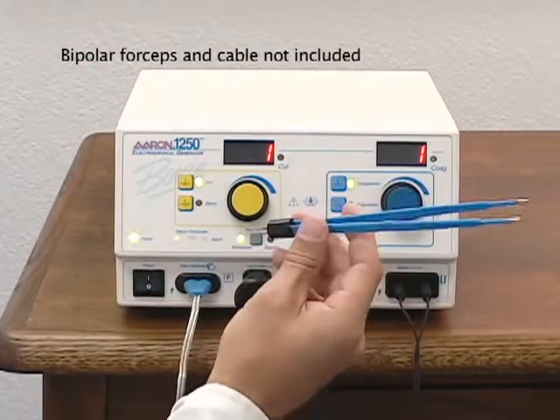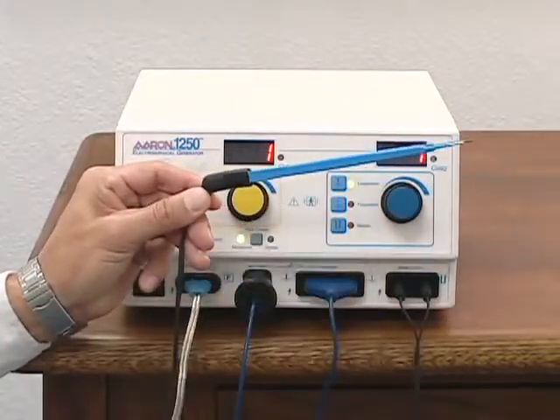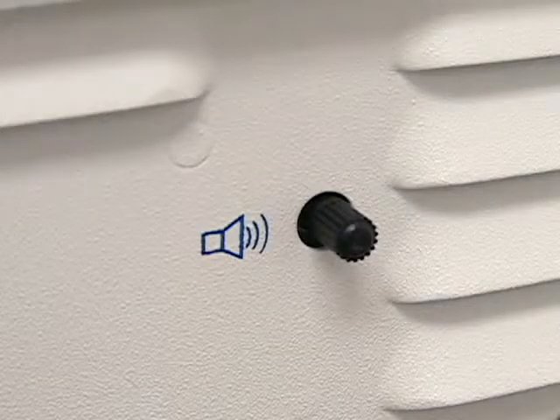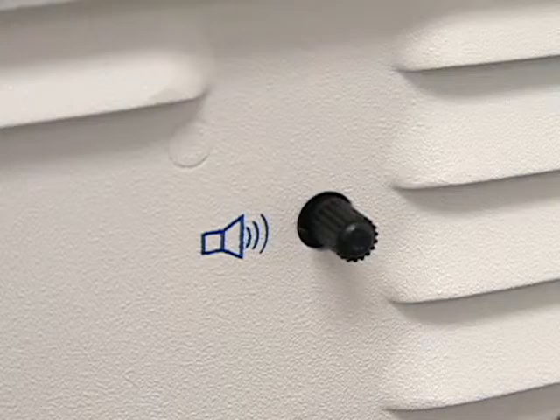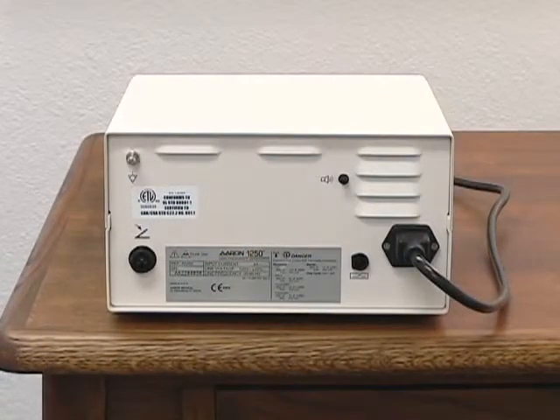To connect the optional bipolar forceps, insert the prongs into the plug. The ARIN 1250 activation tone volume is adjustable. To adjust the volume of the activation tone, rotate the volume control knob on the back of the unit — clockwise to increase, counterclockwise to decrease the volume. The alarm tone volume is not adjustable.